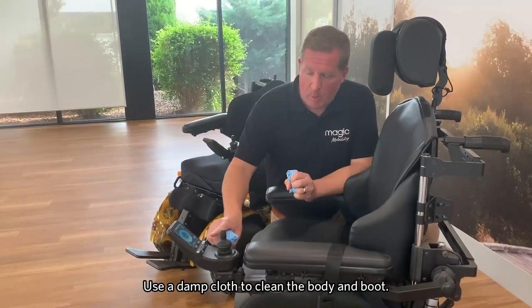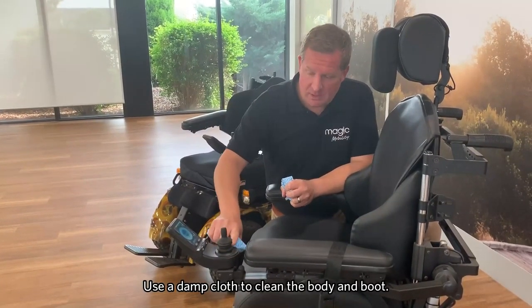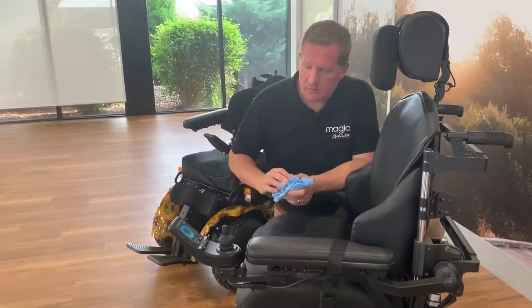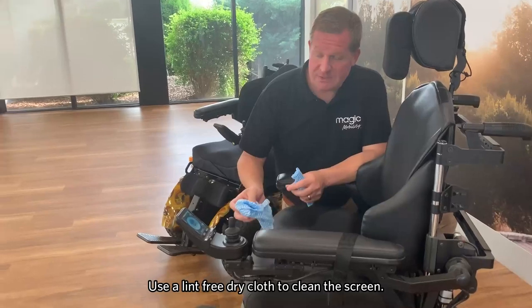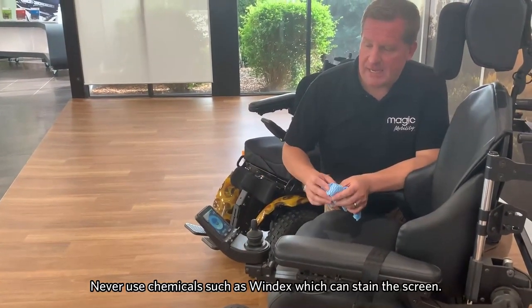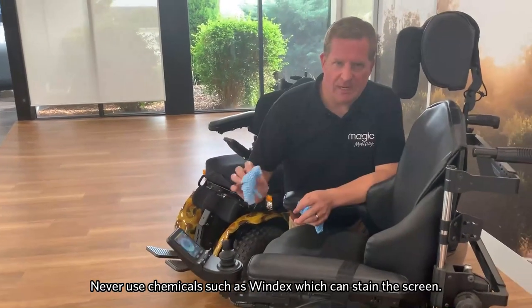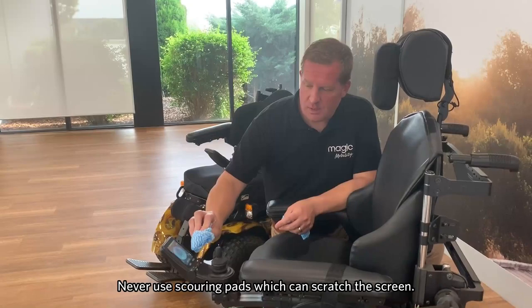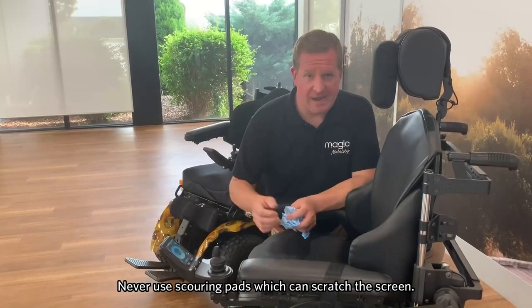When looking to clean what we call the body and the boots of the joystick, we can use a damp cloth. But when cleaning the screen, it's best to use a lint-free dry cloth. Also try not to use any chemicals such as Windex, because that can stain the screen, and you may also scratch it if you use things like scouring pads.